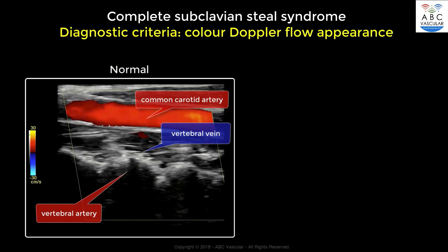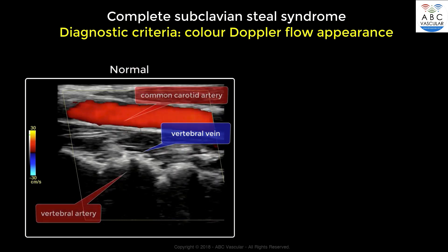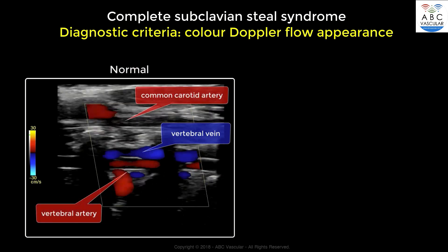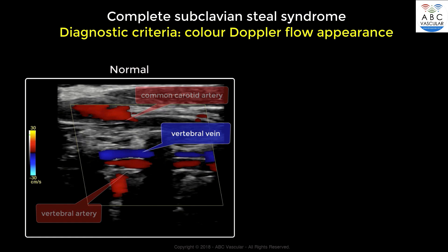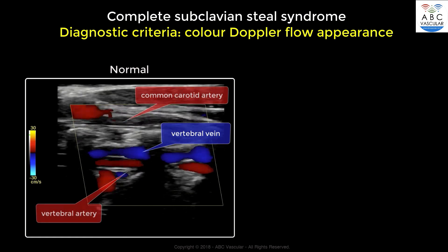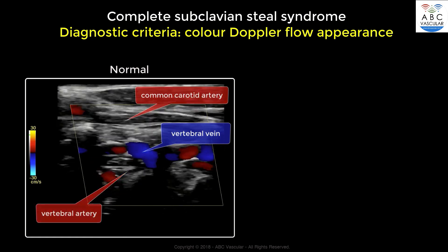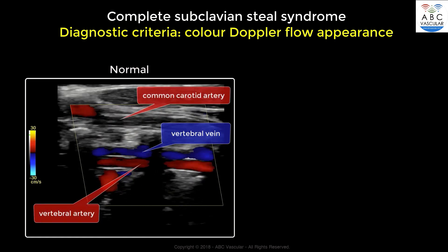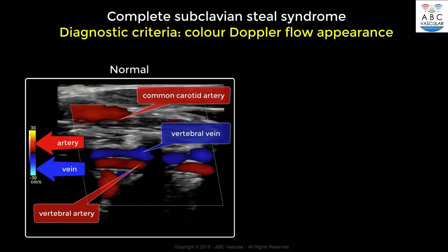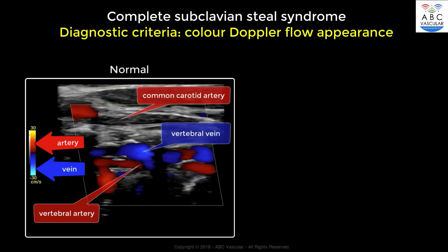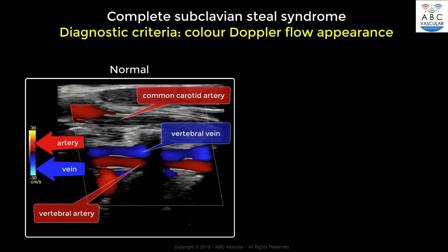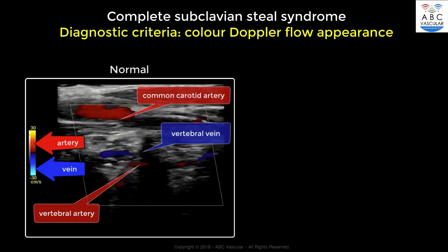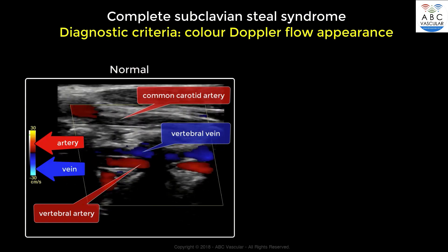In the absence of pathologies, the common carotid artery and the ipsilateral vertebral artery present with the same color Doppler flow appearance. Thus, if red on the color bar indicates arterial flow, both the common carotid artery and the vertebral artery will appear in red, while the vertebral vein will appear in blue.